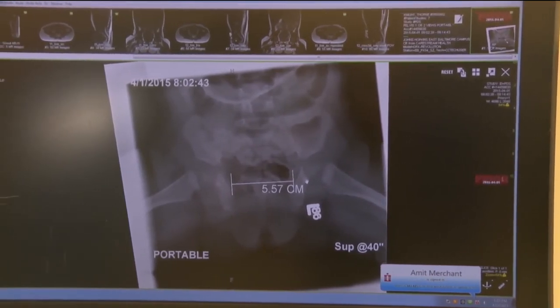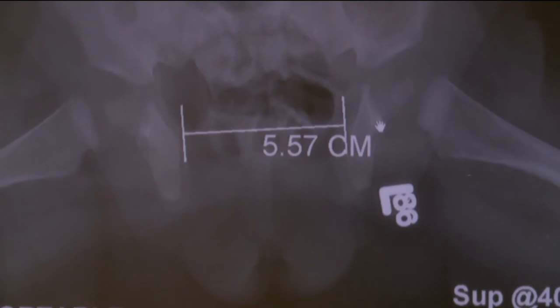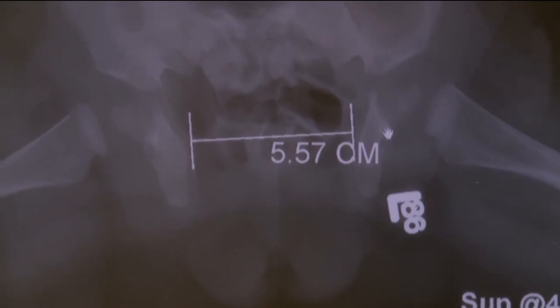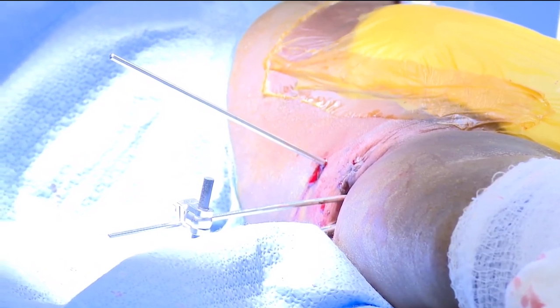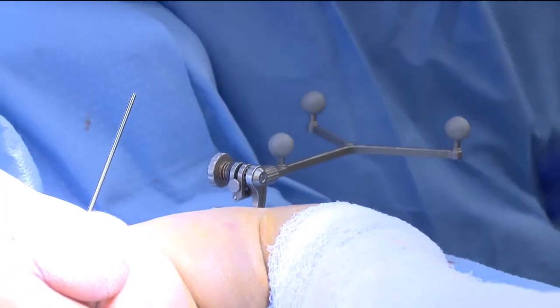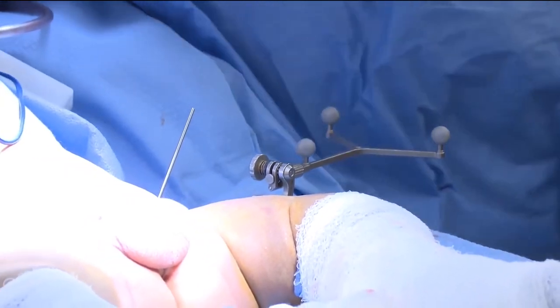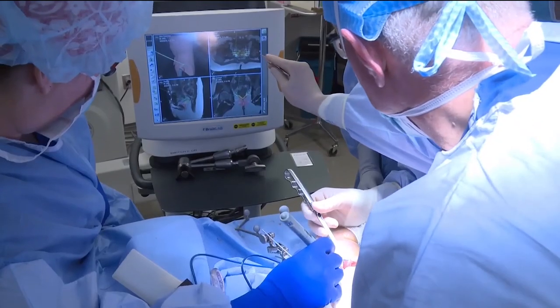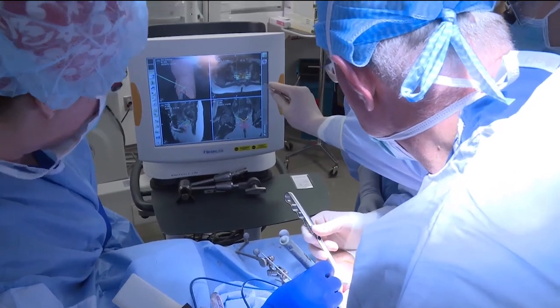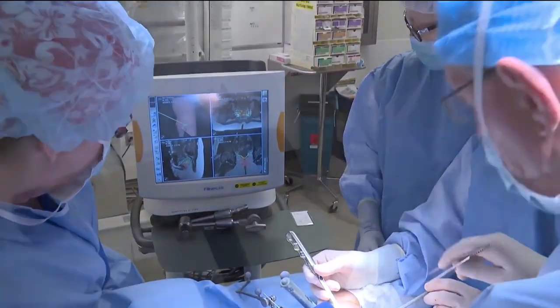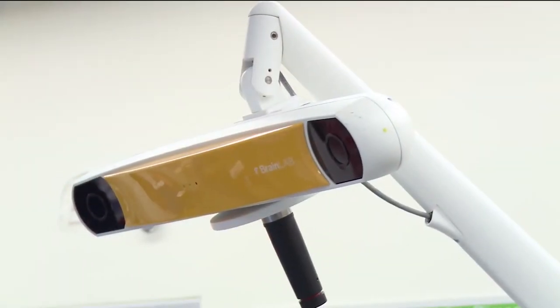This step is performed prior to the pediatric orthopedic surgeon performing pelvic osteotomies. The patient is then prepped and draped, and osteotomies are performed. Anatomic accuracy is correlated and the soft tissue dissection is performed with guidance of the pelvic floor anatomy utilizing the MRI.